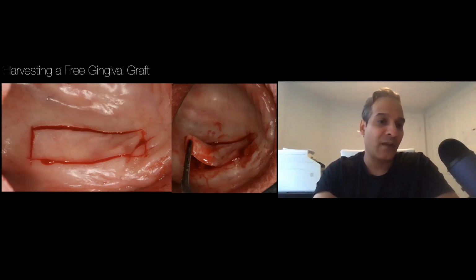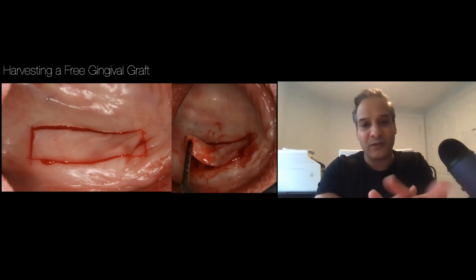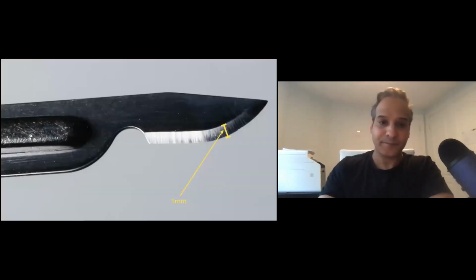Because you start off with an angled incision, I sometimes make my graft incisions a little bit larger than what I need, because when you start to go into those incisions and split the tissue, the edges of the graft end up getting thinner. They'll almost have a ramp on them, and that thin tissue is sometimes useless. So if you're going to angle it and lose some of the volume and thickness, make it a little bit longer so that you can compensate for that.